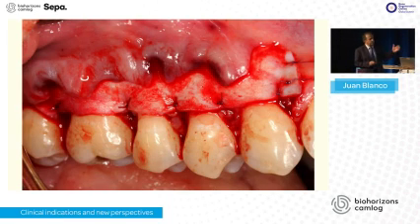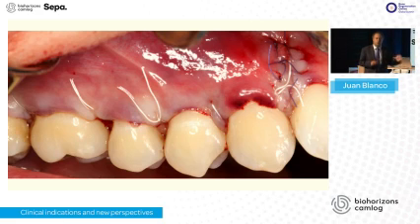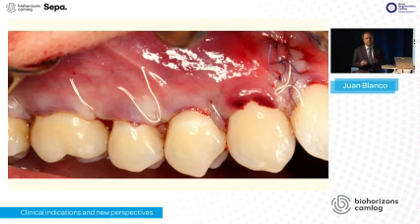We go for the suture, as you can see here, and finally, we proceed with the advancement of the flap. And then with sling sutures, we suture everything, we cover everything. In our opinion, it's important to cover this Novo matrix, this membrane, to avoid not only resorption of the Novo matrix, that's clear, but also the risk of possible infection.